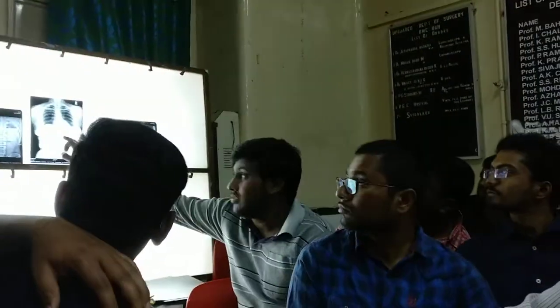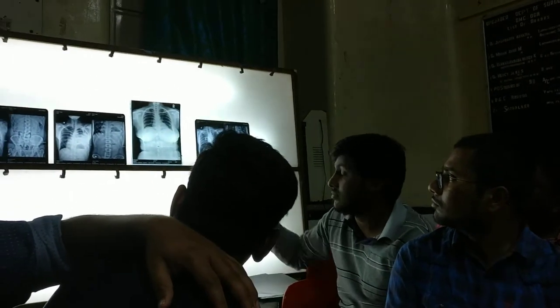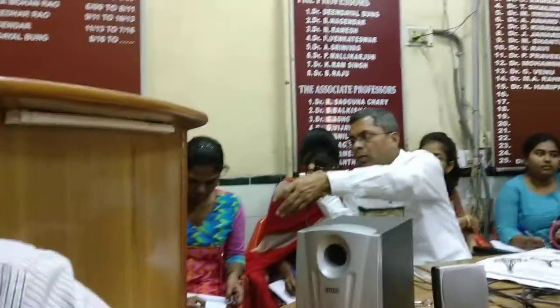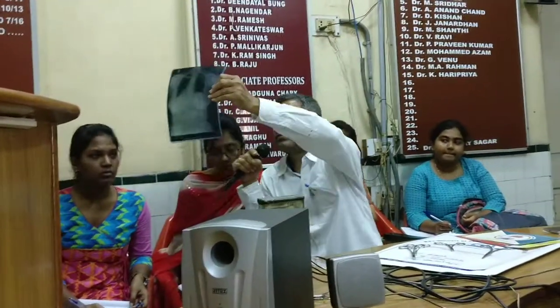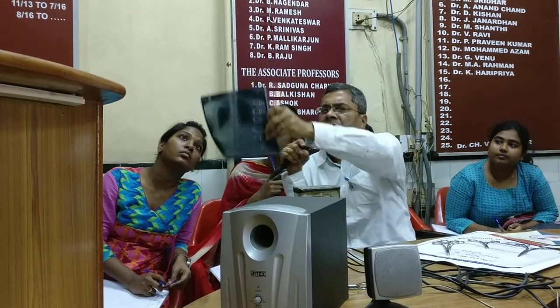Sir, what is that? Mammography. We look at the X-ray here. Implants. Breast implants. This is not mammography.